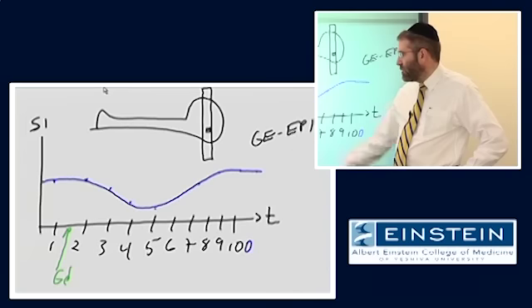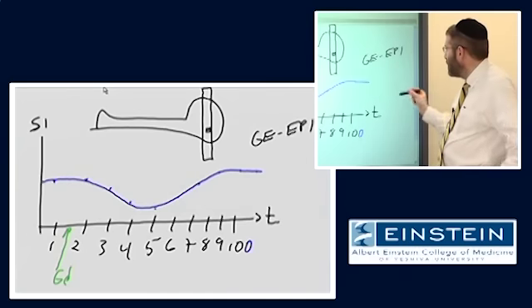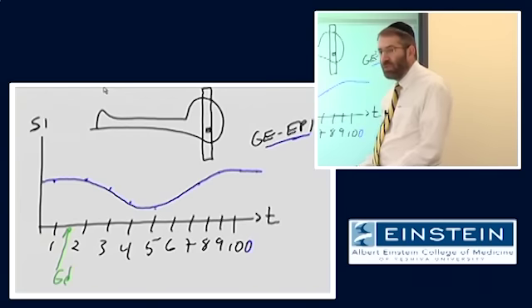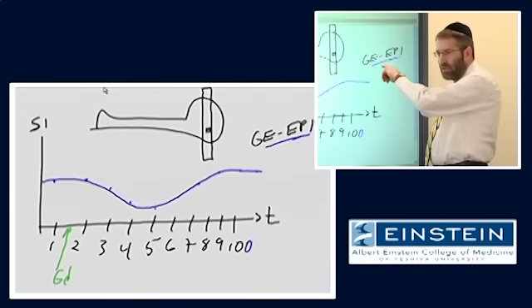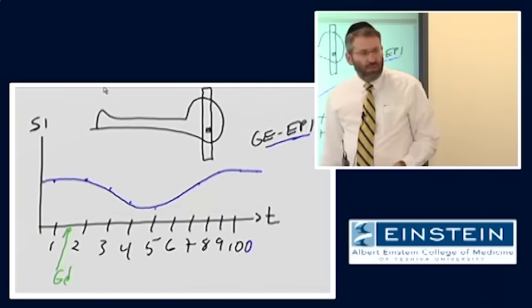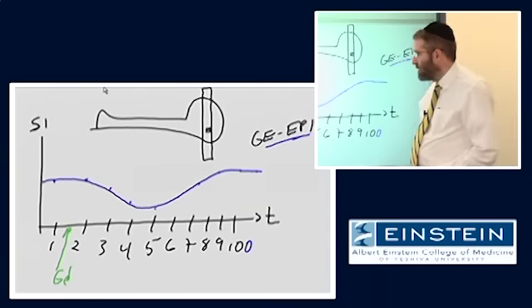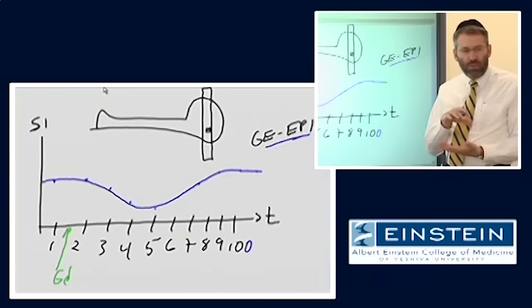In order to do this, we need to image very quickly. We need to image with an approach that is sensitive to these effects. And if we want to maximize our sensitivity, the two things we can do are to use the most sensitive imaging technique and to use the largest amount of contrast that we can. It's also important that we give this contrast as a very compact bolus.